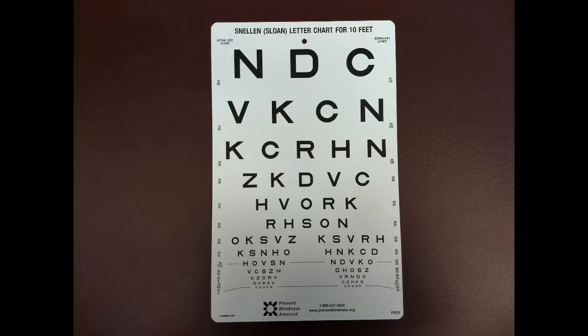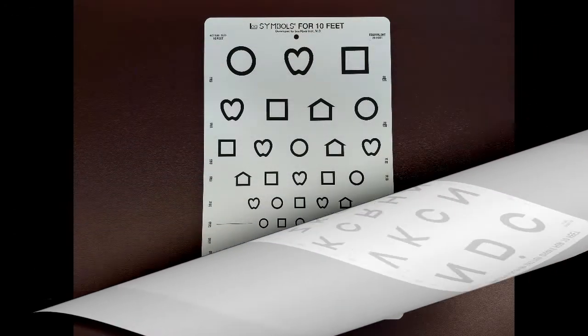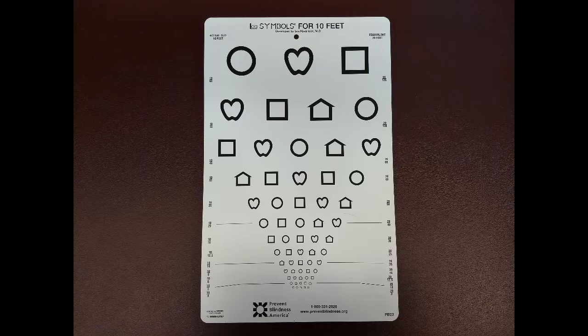This process should be completed for each individual eye and then with both eyes uncovered. While a traditional Snellen eye chart involves letters, there is also a picture version that can be used when assessing small children.